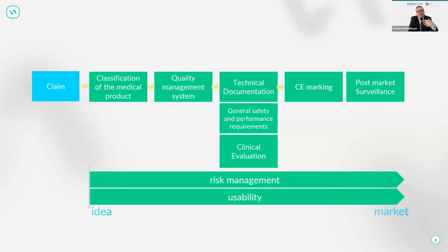Why is that? From the regulator's perspective, it's quite simple. From the regulator, you can just look into a physical device like a syringe, and you see everything. You can see and measure, you can verify, you can see drawings, leakage, materials. You can see it all. For a software, that's a bit more complex, because you can't see how the software really interacts and how it really works. You can see code, you can see workflows, you can see the flows in the code. However, what you cannot see is what is really happening. Well, at least nowadays you don't do that anymore.